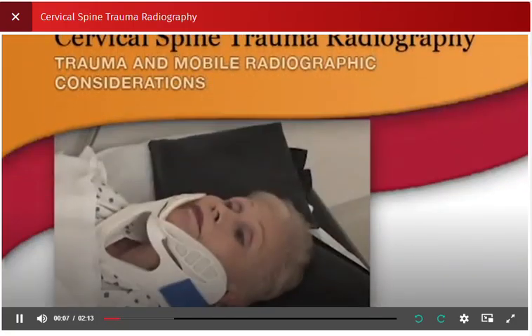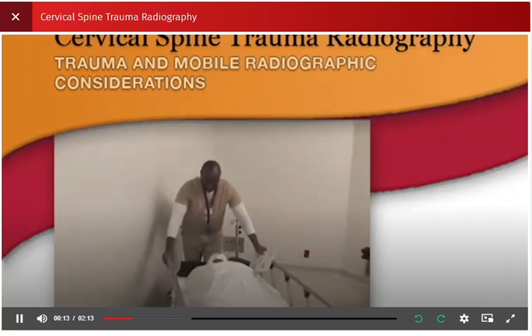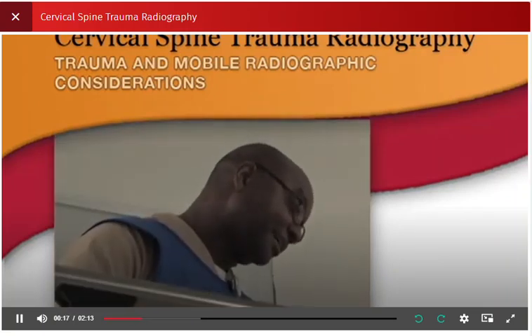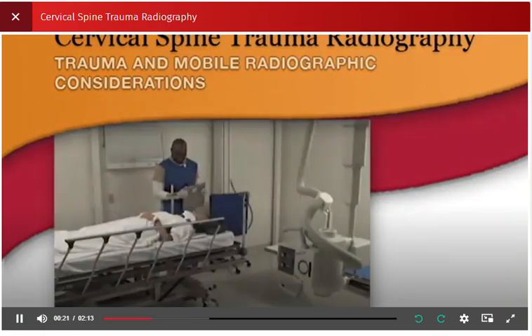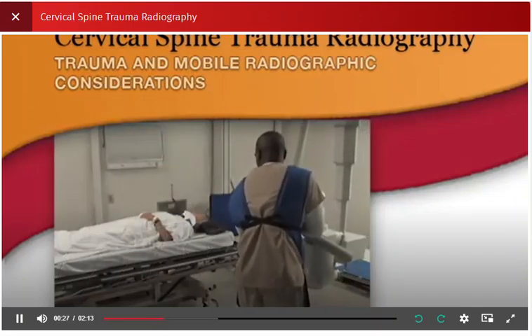When caring for patients with traumatic injuries, the radiographer must use extreme caution when making initial diagnostic images, because the slightest movement may cause severe injury. With the trauma patient, the cross-table lateral cervical spine is common and obtained immediately on the patient's arrival to the emergency room to rule out fractures, dislocation, or other abnormalities.